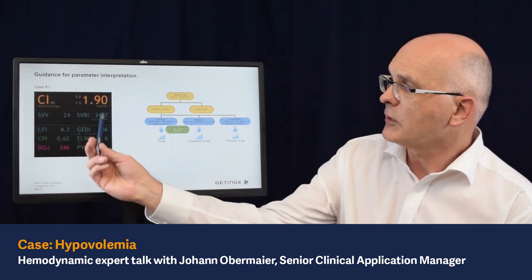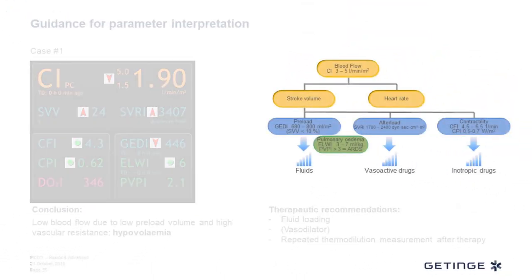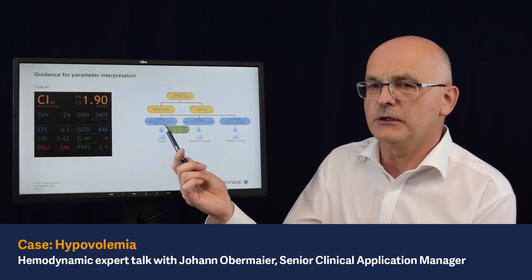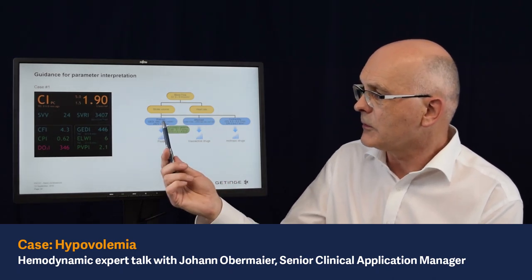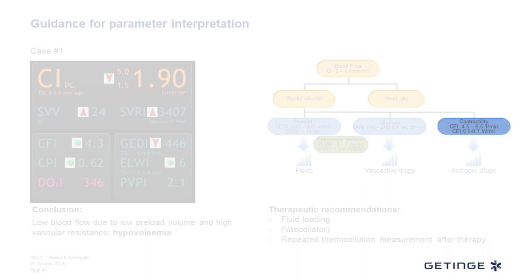Here are some examples of measurement results in certain patients. We have the results screen with different parameters, and on the right-hand side we have the overview on the physiology and the physiological model, which starts with the blood flow and also shows its determinants: preload, indicated by the global end-diastolic volume index; afterload, the systemic vascular resistance index; as well as contractility information with the cardiac function index and cardiac power index.